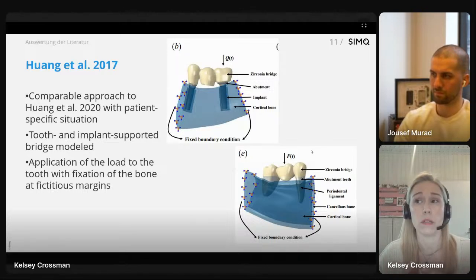And what we do at SimQ, since it's medical device related, we take all of those digital twin simulations, and we use sources like OpenSim, the benchtop testing that I referred to.